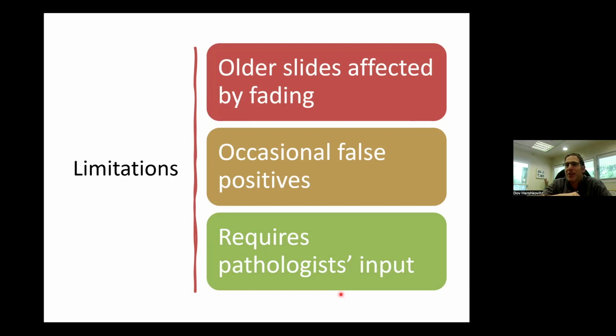Okay, so it was classified as positive for ganglion cell, but by the non-experienced pathologist, and as you said, it's the lesser mistake, and nevertheless, even this lesser mistake was extremely uncommon in our cohort.